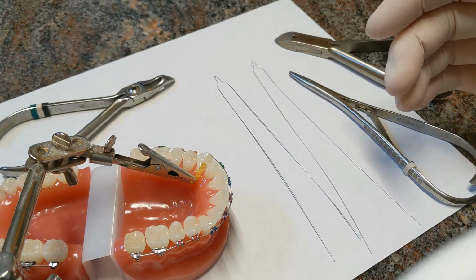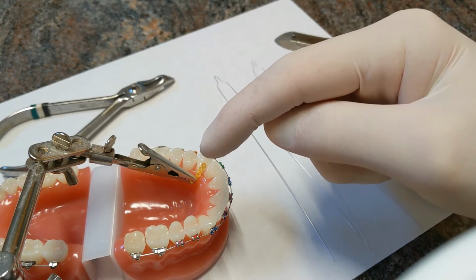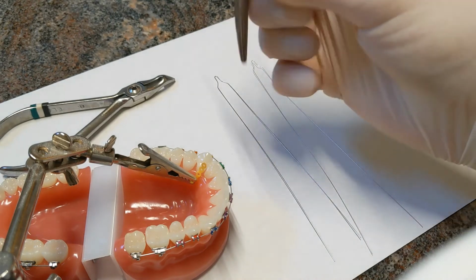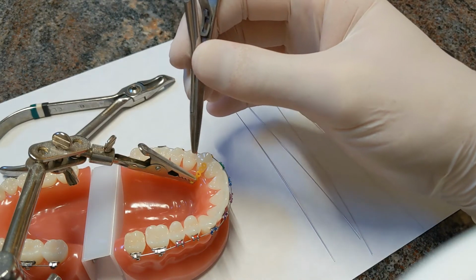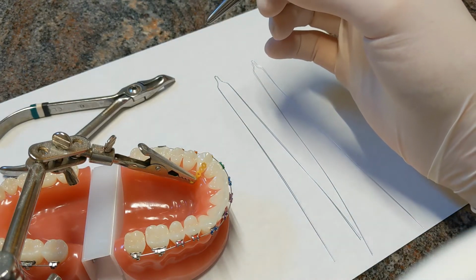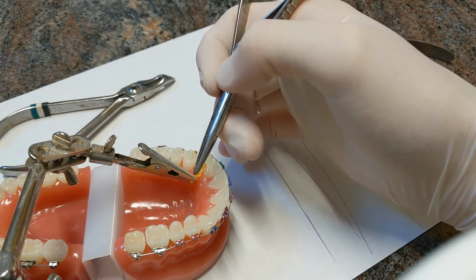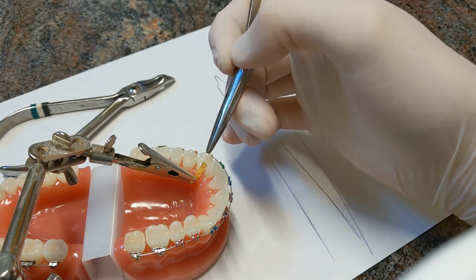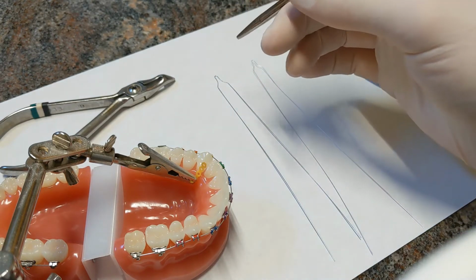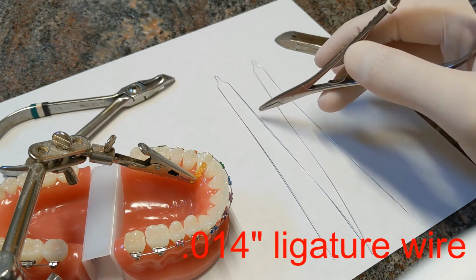So when the patient comes, they will have had the surgery. The oral surgeon would have uncovered and exposed the tooth and placed a gold chain on the impacted tooth. So the chain will be coming out of the roof of the mouth. And I didn't have gold chains, so I used a gold-like elastic chain that we have. This won't be in the patient's mouth. What you'll see is a gold chain coming out of their gums, and it's usually tied to the wire or something like that. So what you'll do to make the hook is you'll get 014 wire, ligature wire.